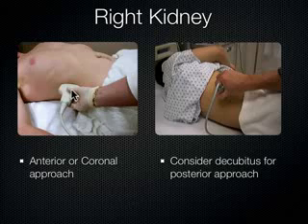Occasionally, though, you got to take the probe and drag it up anteriorly, up here. But whenever you drag the probe anteriorly, keep in mind the kidneys are still kind of a posterior structure, so to compensate for dragging the probe anteriorly, you're going to want to also fan the probe posteriorly. Okay, so I'll say that again.